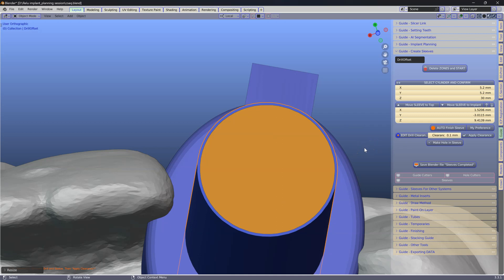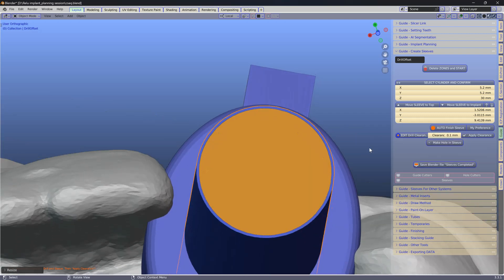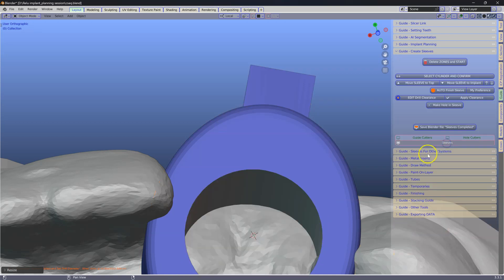Also if you do have a metal sleeve that requires a certain diameter, make sure you get the diameter correct and we are going to apply that. Next, make hole in sleeve.